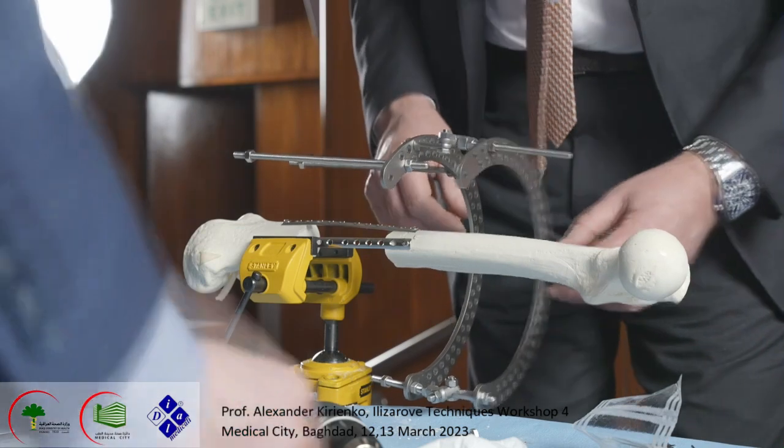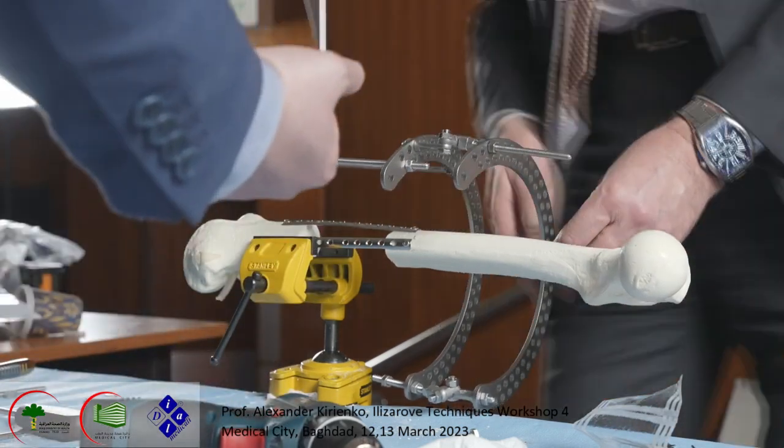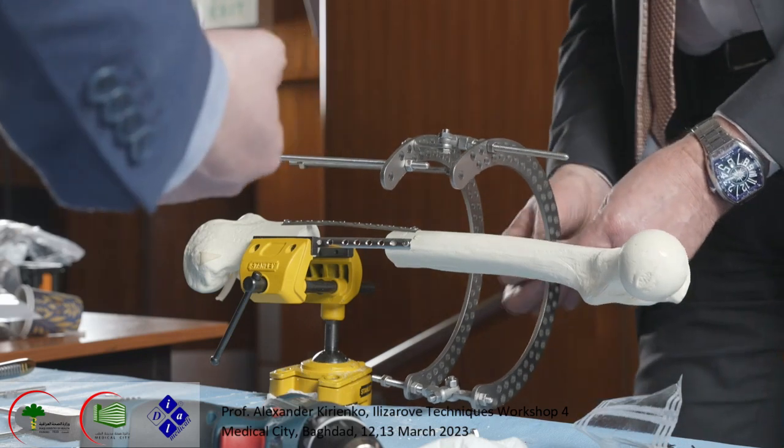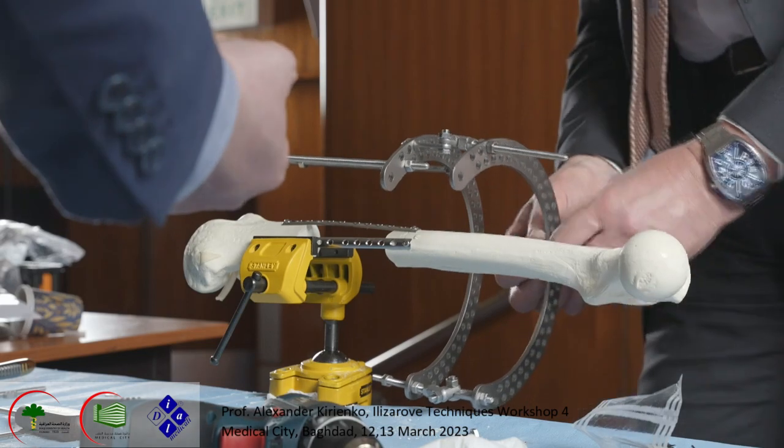Okay, you see this hinge we create, and later maybe do another one.